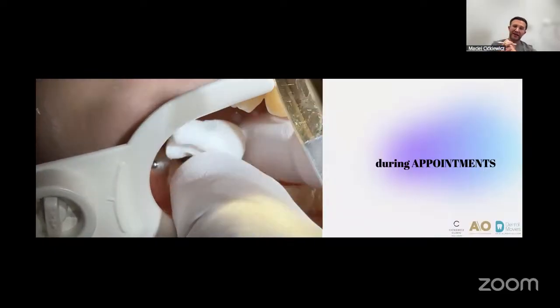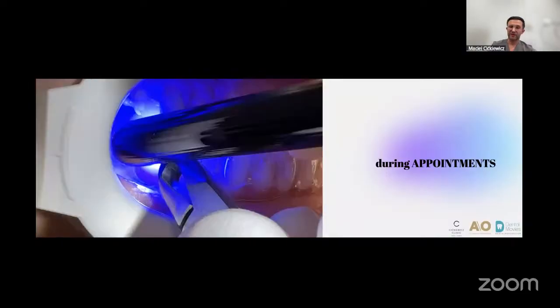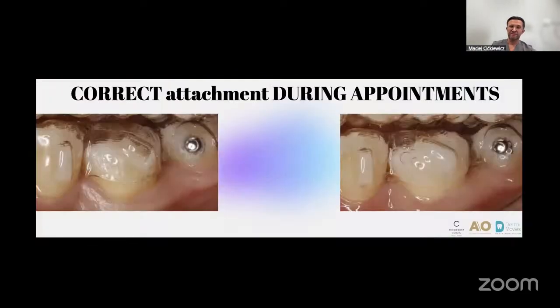We can delegate these people to other projects. Here you can see how the correct attachment during appointments works. We have small spaces on it, and of course it's not good in some way, but it will work for a while.